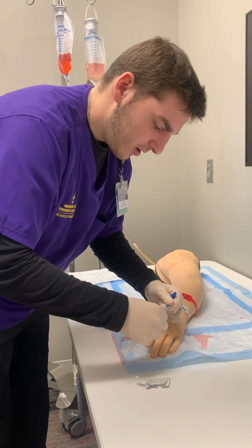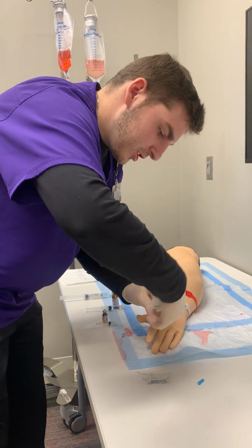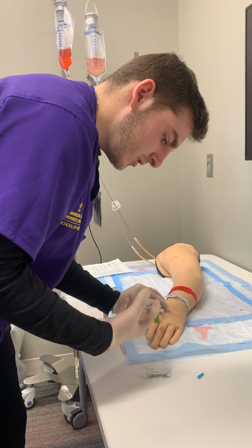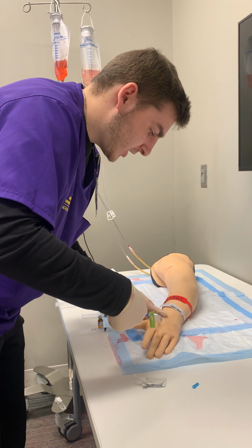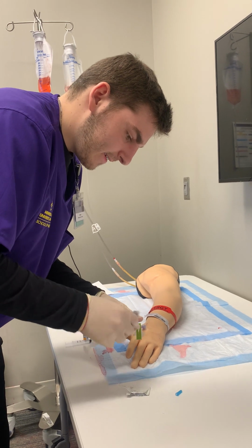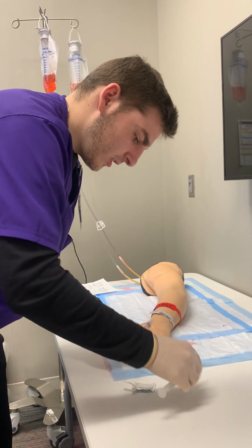Now take this cover off and flush, just checking for patency, which I'm not really able to do much. So I'm just going to verbalize that I'm flushing this and checking for infiltration, any signs that it's not actually getting into the vein. All right, then I'm going to recap this.